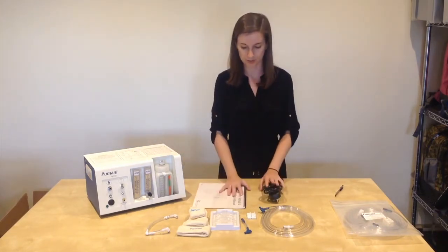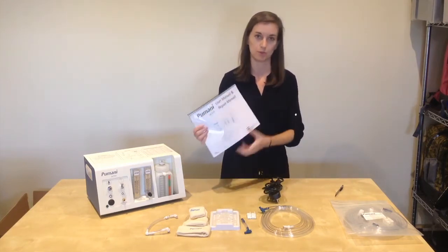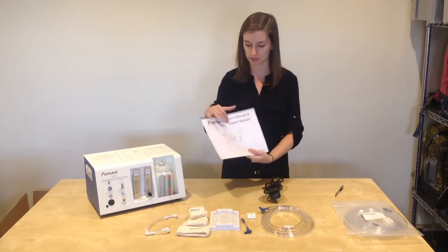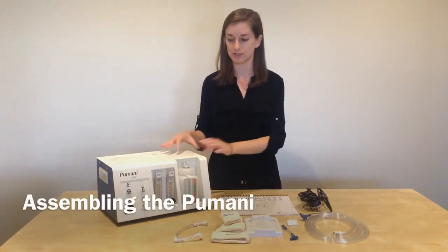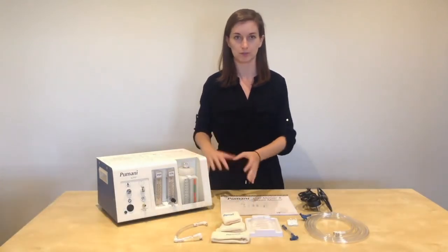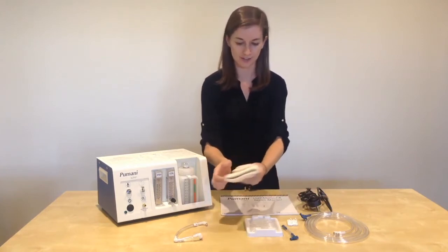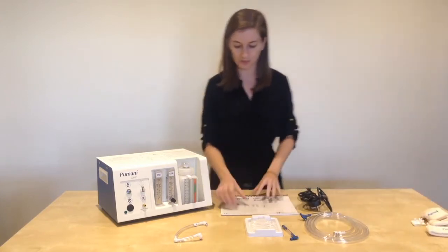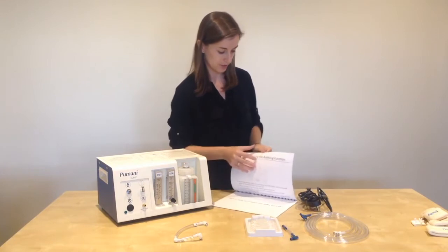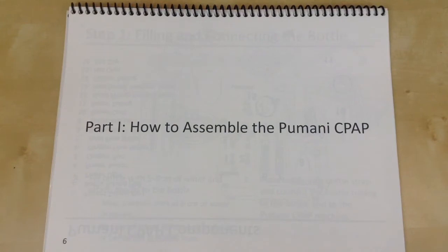These are all the components that you need to start Pumani therapy. In the user manual and repair manual, you will see the step-by-step instructions on how to assemble the Pumani. We are now going to explain how to assemble the Pumani before it goes on the baby. If you want to follow along in the user manual, we will be starting on part one: how to assemble the Pumani.